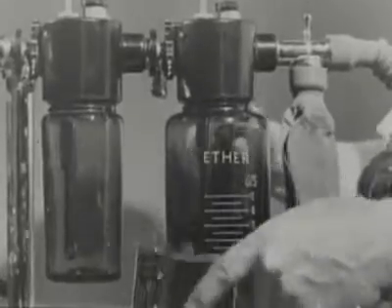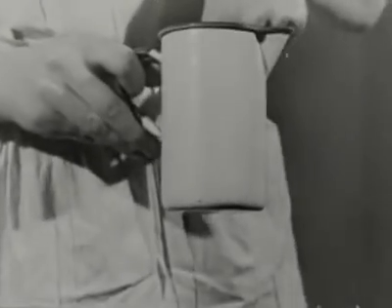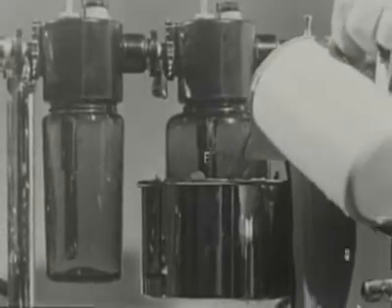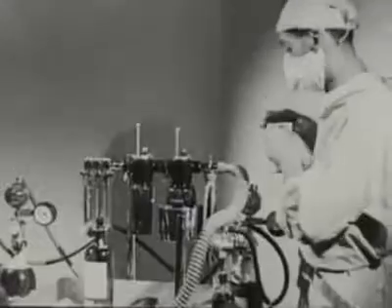The ether bottle is surrounded by a can into which warm water may be poured. The water should be not hotter than 90 degrees Fahrenheit, or the ether may boil. As ether is vaporized, it cools, and the concentration of vapor falls. This water jacket delays cooling.